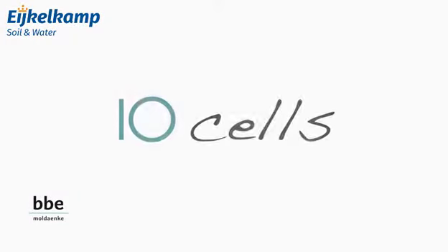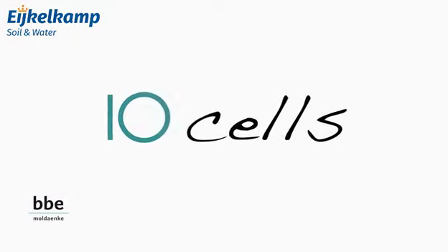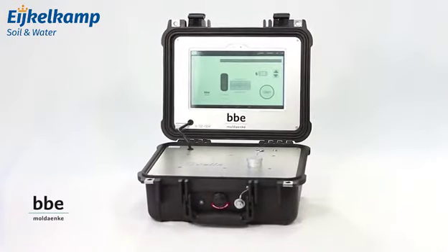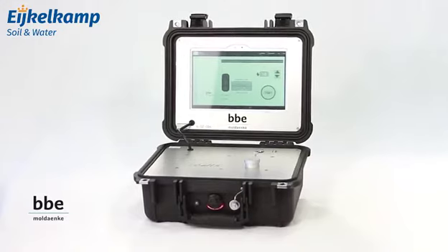Our newest development is the TenCells — the easiest, fastest and most precise device for indicative testing of ballast water. Let's see how easily a measurement with TenCells can be performed.